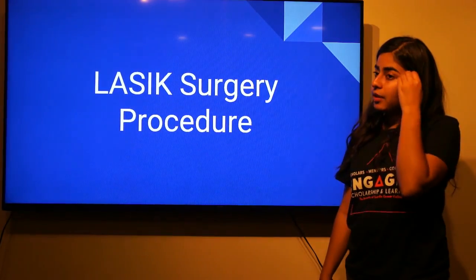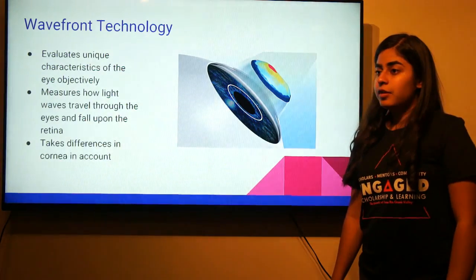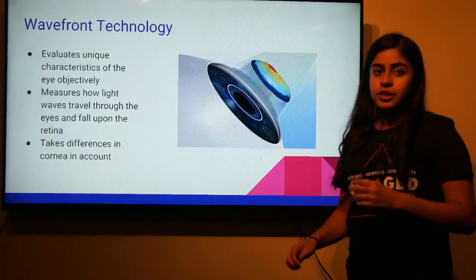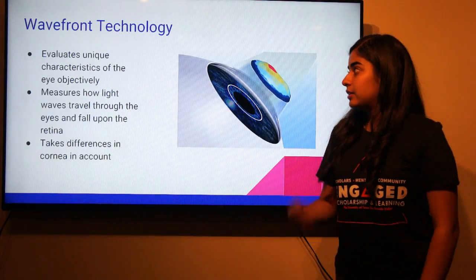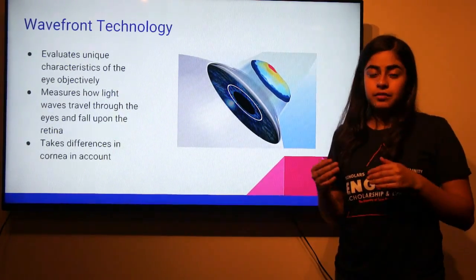So now we'll be describing the steps of the LASIK surgery. So wavefront technology is a new technology which is used to measure the power of the eye. So it evaluates the unique characteristics of the eye objectively.